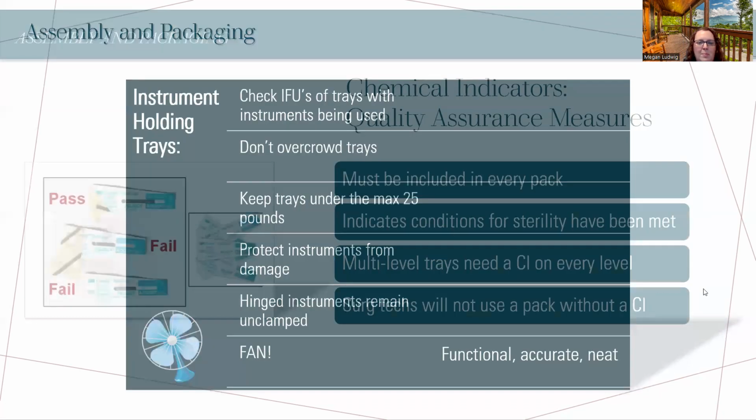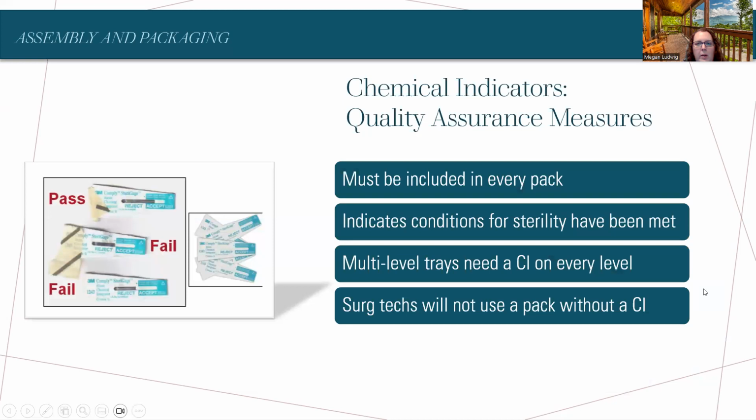Okay, FAN. So let's talk about chemical indicators. We're talking about our tray of instruments. You've got your tray, you've got them neat, functional, right? All laid out in there.